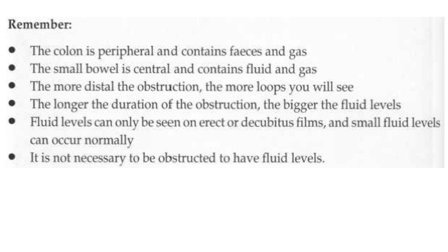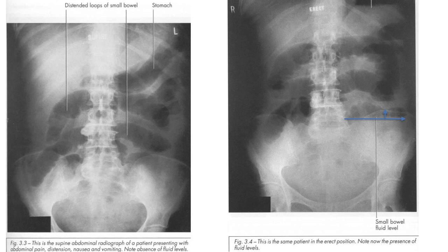Okay, so let's jump into small intestinal obstruction. When you receive any patient with abdominal distension, you have to request a series of radiological studies. First request an ultrasound, because it's cheap and you can get the result very fast. Then request the abdominal X-ray, the three views we talked about at the beginning of the class: lateral decubitus, supine view, and erect position.